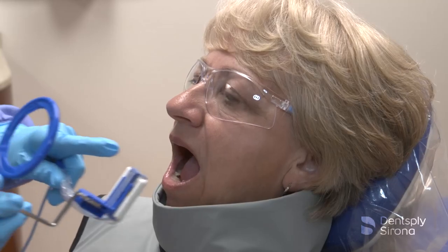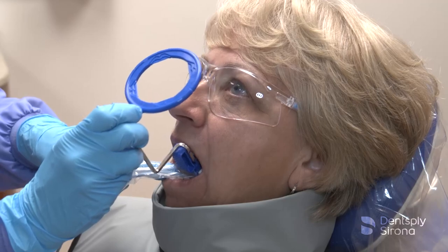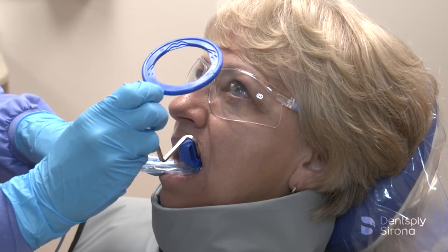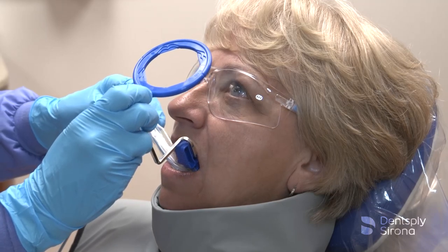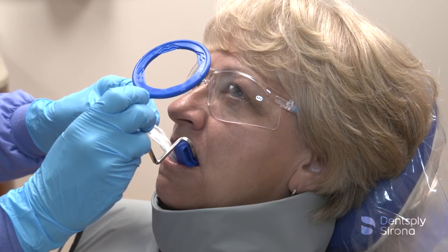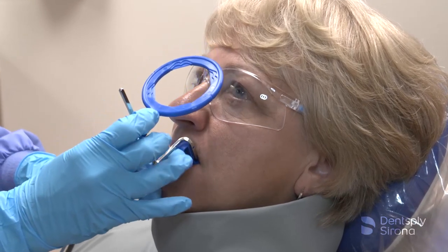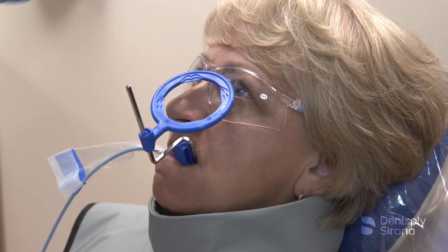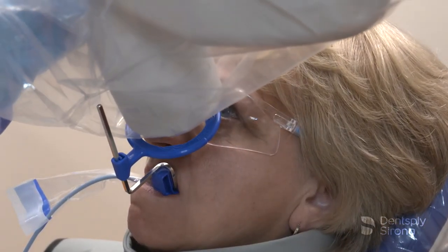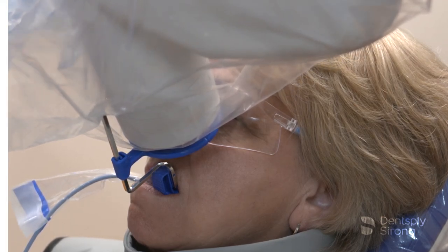Continue by capturing both the right and left maxillary canines. Center the sensor behind the maxillary canine and first premolar and position it in the center of the mouth. Place the center of the bite block on the incisal edges of the maxillary canines and instruct the patient to close slowly. Once the bite block is in place, slide the aiming ring down the arm close to the patient's face, align the tube head in close approximation to the aiming ring and center it. The X-ray image is now ready to be captured.